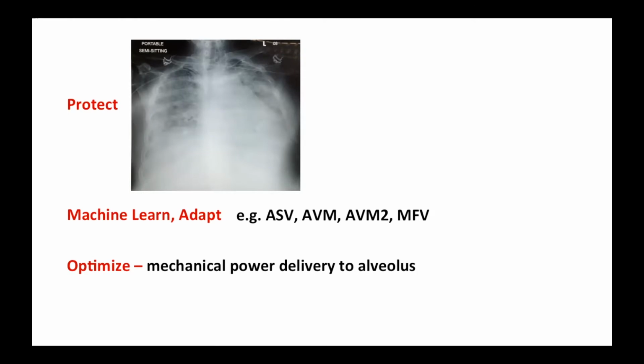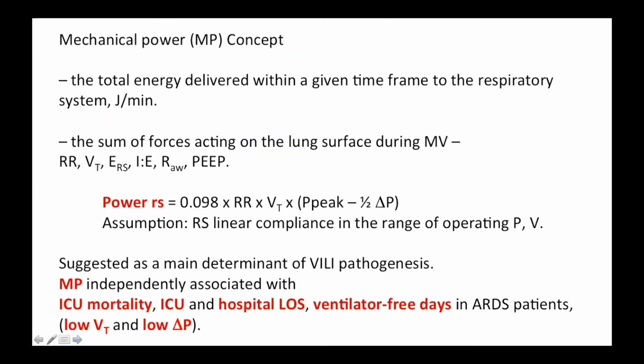And then we will be able to apply our ability to protect in certain ways, such as with machine learning and adaptive technologies. And ultimately, we have to try and optimize. And what we are trying to optimize, I believe, as Marini and others and Gattinoni have said, is the mechanical power delivery to the alveolus.